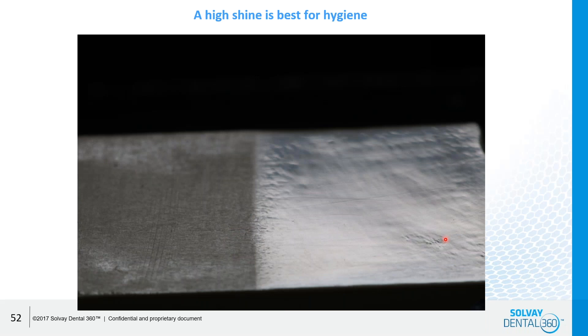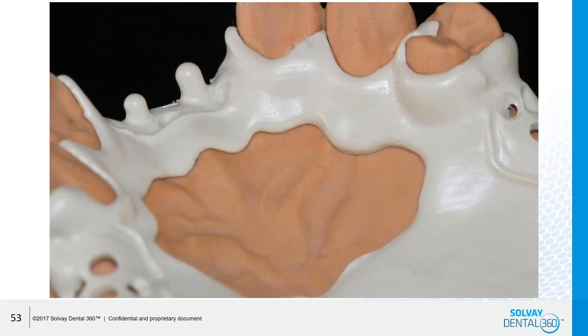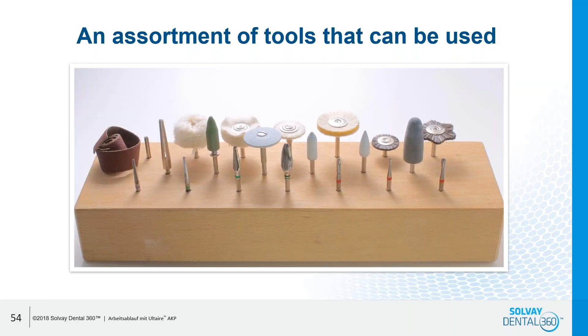A polished or shined finish is needed and works best. Once you finish the partial, take it out of the disc, cut it out, do the finishing, you can polish it and then proceed to the final setting of the teeth and processing the old conventional way. That's a polished and fitted case — very precise fit and ready for the teeth buildup and processing. The tools used on this material are just the typical cross-cut burrs, polishers, bristle brushes — nothing very special, just the same tools we have around the lab in general.